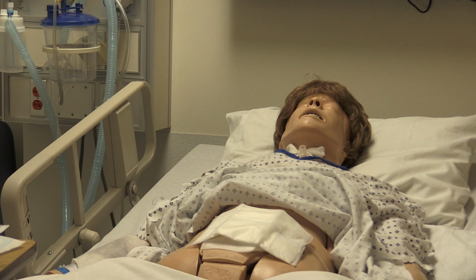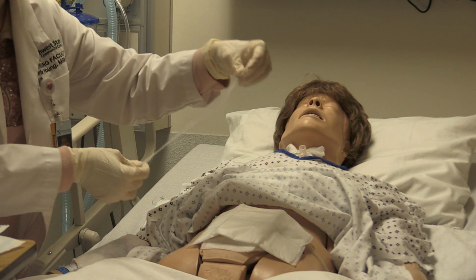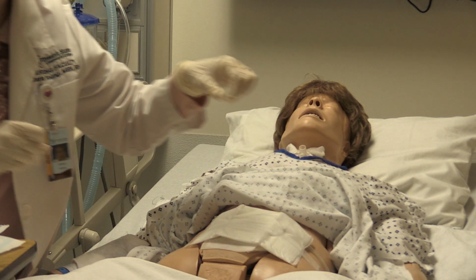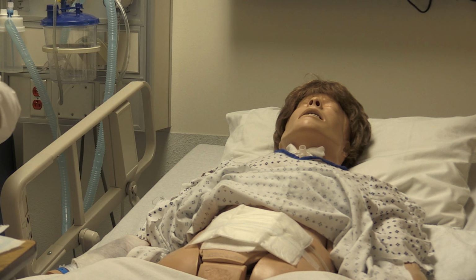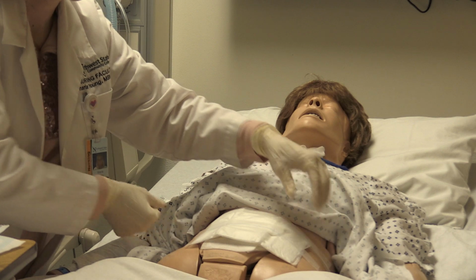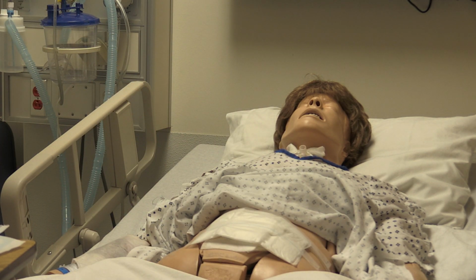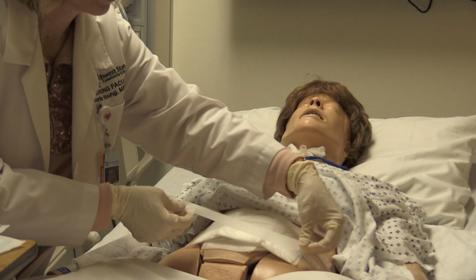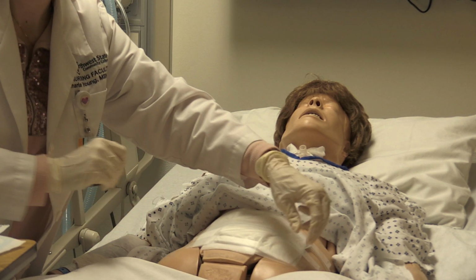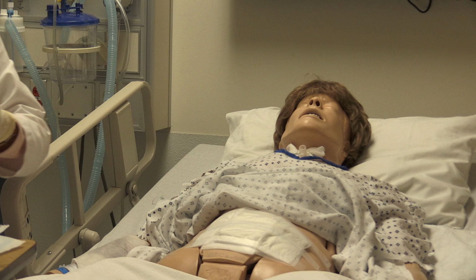Cover that, and then I'm going to take my tape, I'm going to go right down the center. Go at the top, and then at the bottom I'm going to create a little tiny bit of a little smiley face because we don't want to get any pubic hair in there, so we're just going to get a little smile.